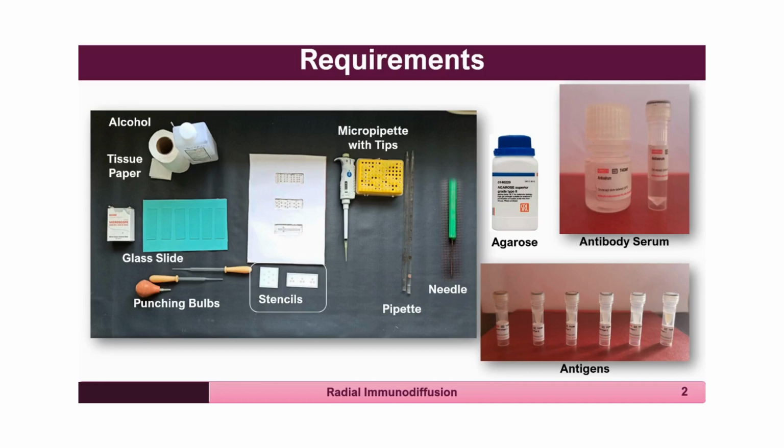This punch is used for punching the wells on the agarose gel, and these wells are used for loading the antigen and the antibody.